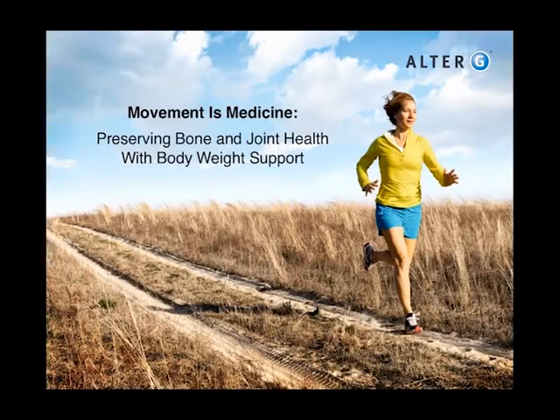The first question that we have coming in is: what is the suggested unweighting percentage that you recommend starting new patients on to measure their pain? So I always start patients at 50% body weight, just because that gives me the opportunity to go up or down. And if someone has OA, I want to make sure they're pain-free. So at 50%, if they still have pain, I can go down to 40%. If they have no pain, I can come up a little bit to 60%. My goal is to make sure they have just enough body weight support. My goal is not to start them at the lightest weight possible, because if they can withstand a certain amount of load, again, with cartilage, they need to have load.